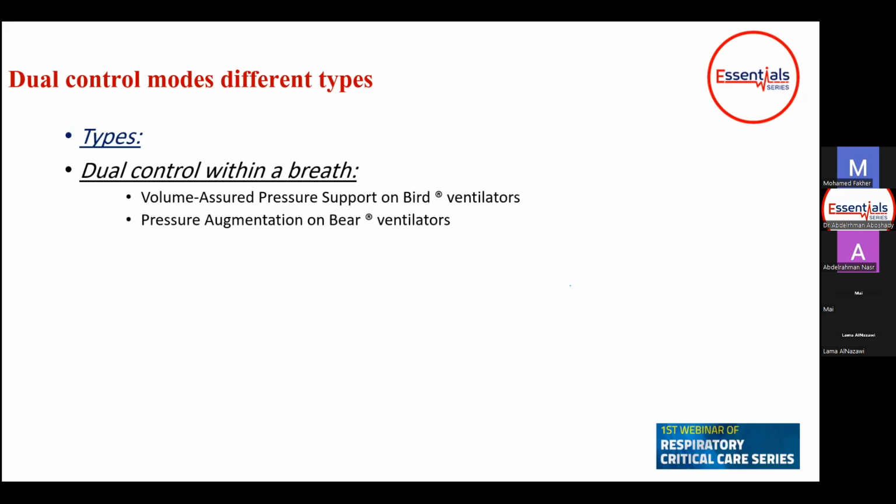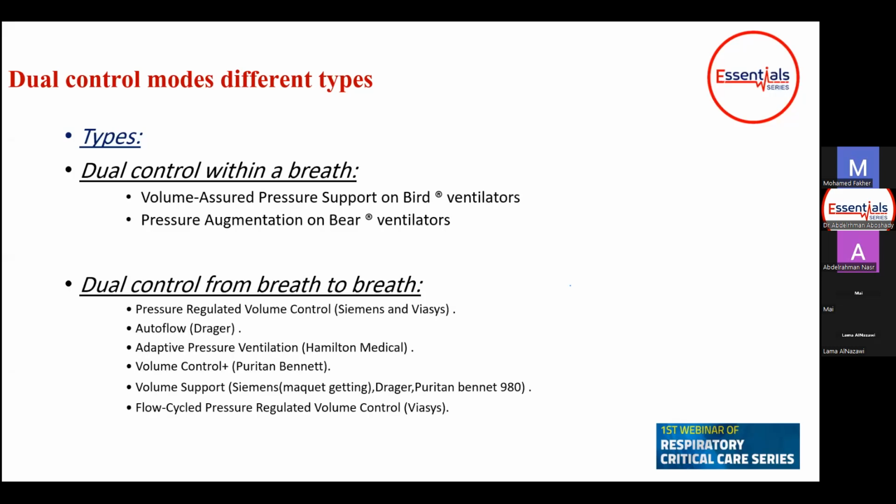Actually, we don't have Bird ventilators in Egypt, so we don't use VAPS anymore. It was available in 2004 and 2005, but I don't think it is available commercially in Egypt nowadays, neither Bird nor Bear.